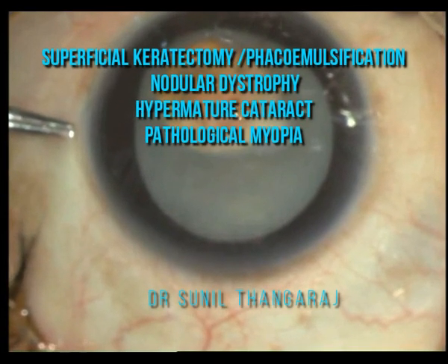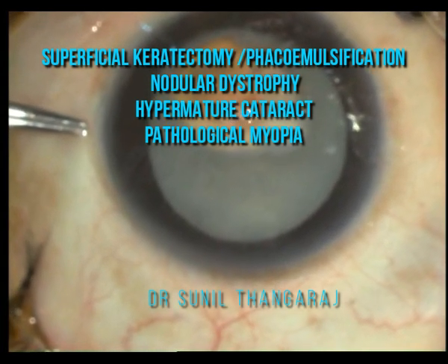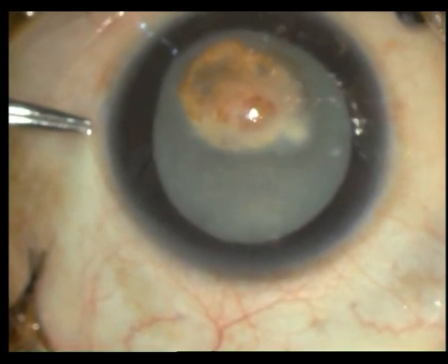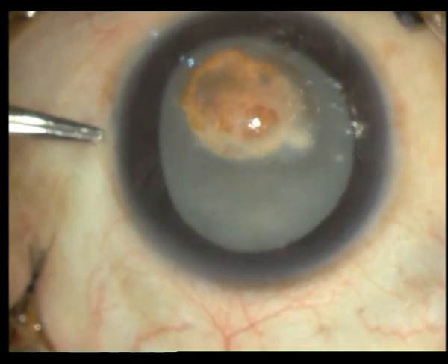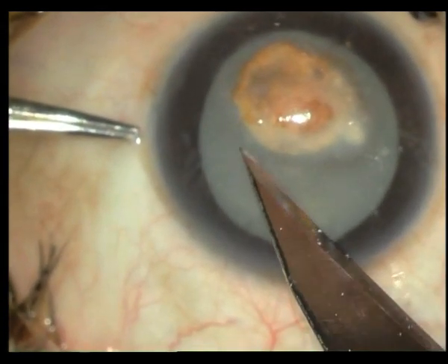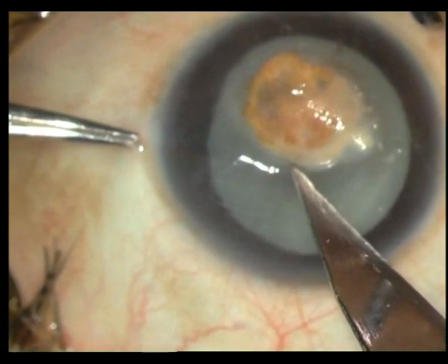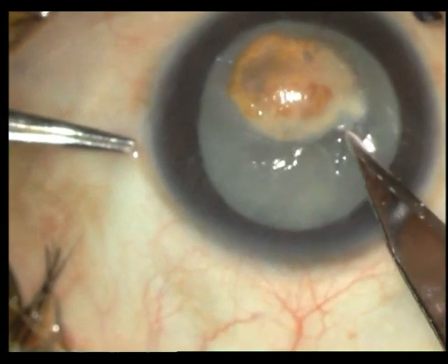This is a young girl with a corneal dystrophy — a nodular corneal dystrophy — with a hypermature cataract, unfortunately in both eyes. We had already operated the other eye and then took up this eye for surgery as well. Initially I am doing a superficial keratectomy. Mind you, this girl is only in her early 20s, and such a waste of so many blind years.